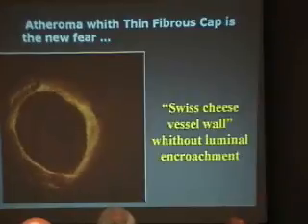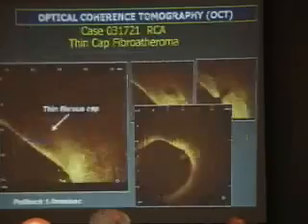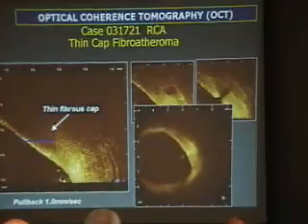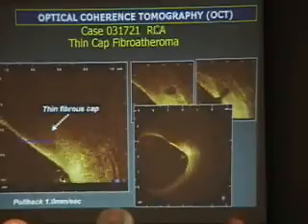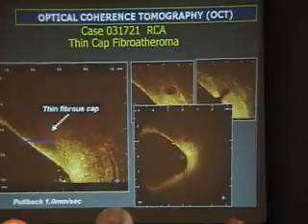And again, to come back to the patient that I showed you, this is the patient that we have seen, and I'll let this run in a loop because there are two pieces of information which are quite amazing. The first one is that at some point you see something very thin here. You see some layer there which might be the media, but going back and forth you regularly find this thin, and I would say, cap.